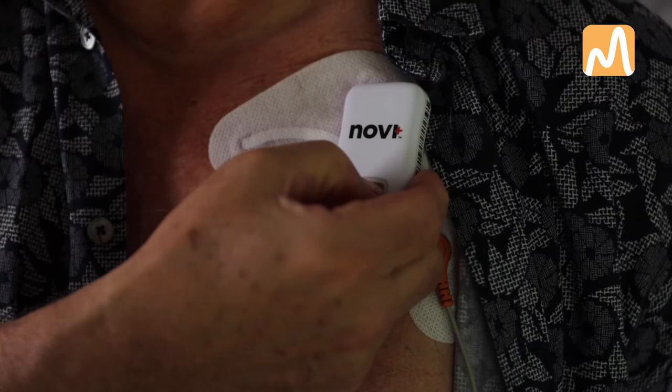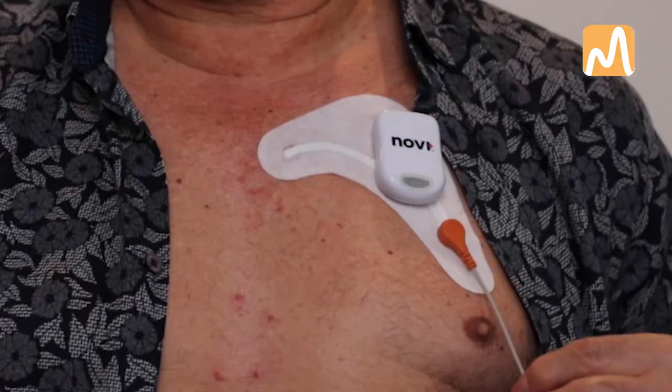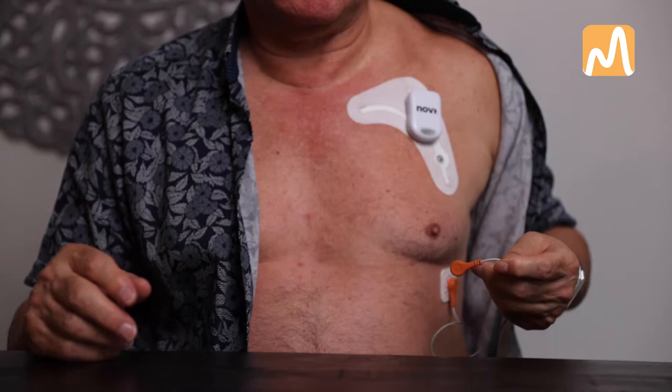If the device flashes red or you suspect it may have powered off, please give us a call and one of our team members will be available to assist you. Please refrain from any activity that may cause tugging on the lead wire. In the event that the lead wire disconnects from the electrode patch, simply reattach.